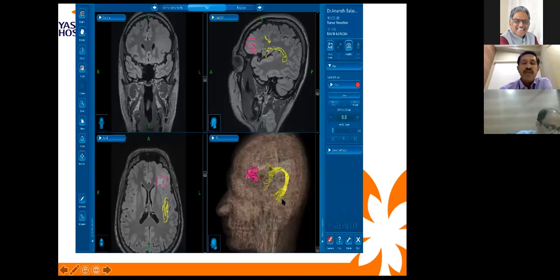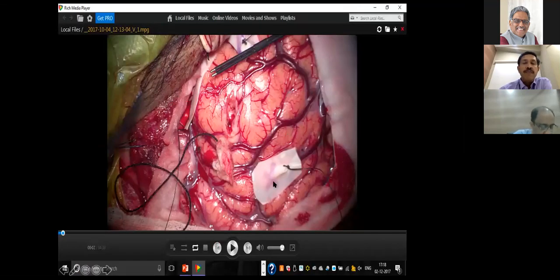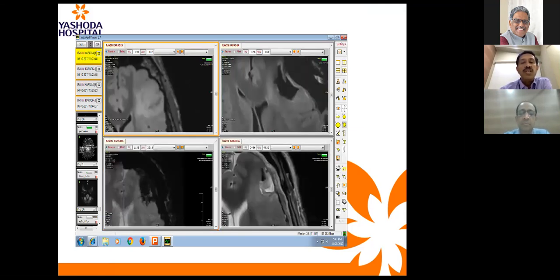And here you can see the arcuate fasciculus being far away. So this is how we have mapped the speech area on the surface. This was the silent area in between. We are making a corticectomy and operating. And this is at the end of surgery, resected with the deep area, which was navigated and preserved. He indeed had a speech arrest when we stimulated here. We could preserve his speech completely. And this one turned out to be a grade 3 anaplastic oligo. And he was sent for adjuvant radiation without any fresh deficit. Otherwise, he would have been deemed inoperable because it is on the speech area.